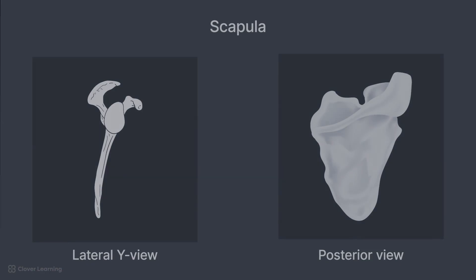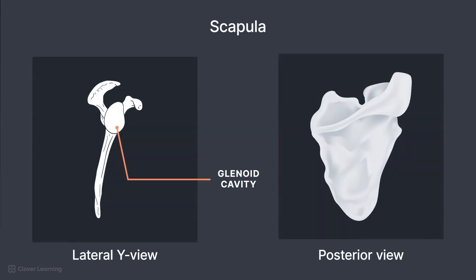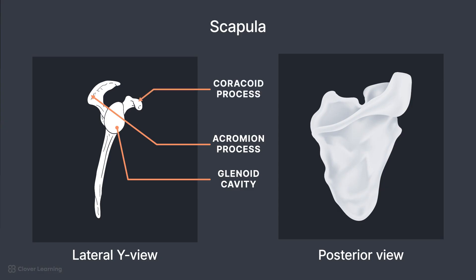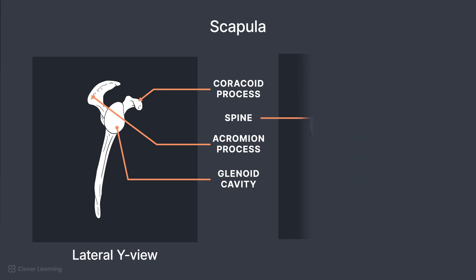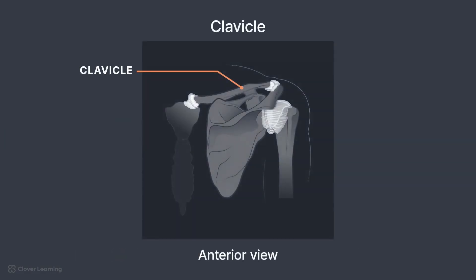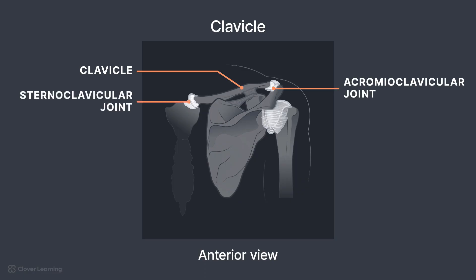On the scapula, the glenoid cavity attaches to the humeral head. The acromion extends over the shoulder joint to articulate with the clavicle, and the coracoid process projects anteriorly. On the posterior aspect, the scapular spine is an important dividing structure for muscles. The clavicle serves to connect the shoulder to the axial skeleton via the acromioclavicular and sternoclavicular joints.